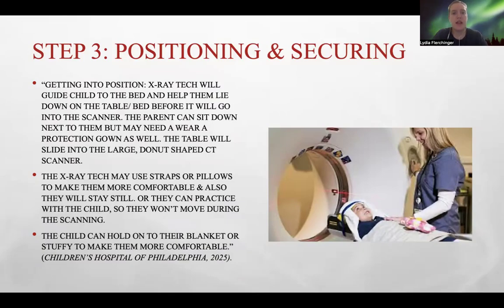Step three, positioning and securing. So getting into position, the X-ray tech will make sure your gown is on, and they'll guide you to the bed or the table and help you lie down before we go into the scanner. Your parents, making sure they're also wearing a protective gown, can sit next to you so the X-ray tech can see you on the bed.